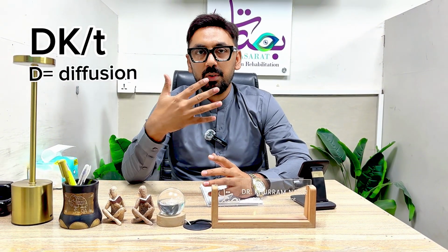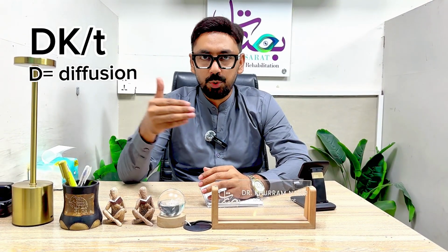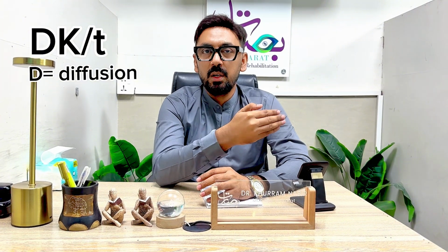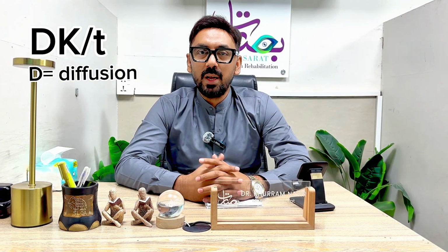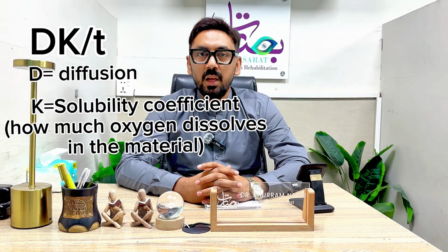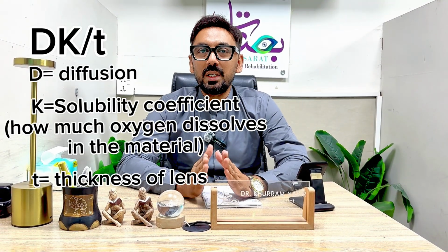In Dk over t, D means diffusion, the process of diffusion. For example, oxygen penetrates or diffuses through the surface of the lens and moves towards the cornea. That is called diffusion. K is the coefficient or the constant, and t is the thickness of the lens. So this is called the Dk over t value.